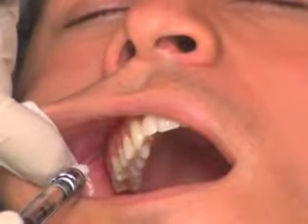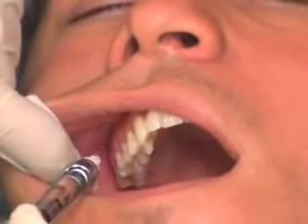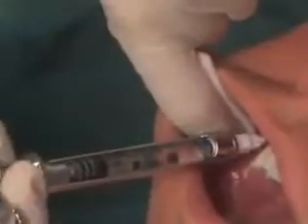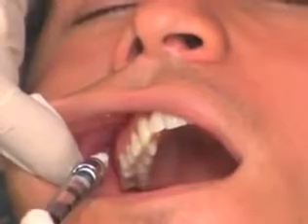The syringe is held in an upwards, inwards, and backwards direction and is inserted to a depth of 16 millimeters. After 2 negative aspirations, a half a cartridge of local anesthetic is administered over 30 seconds.